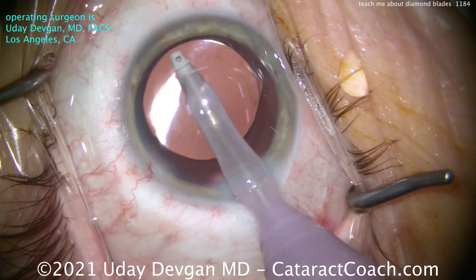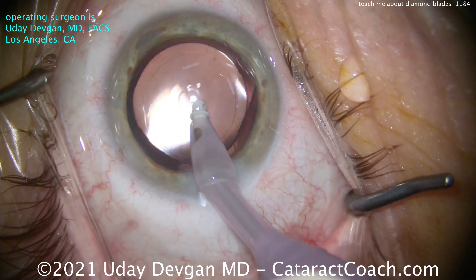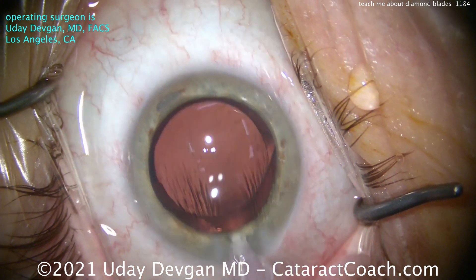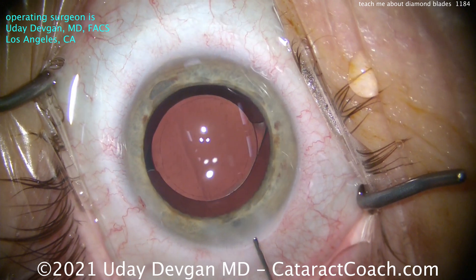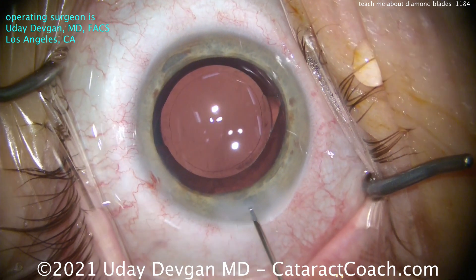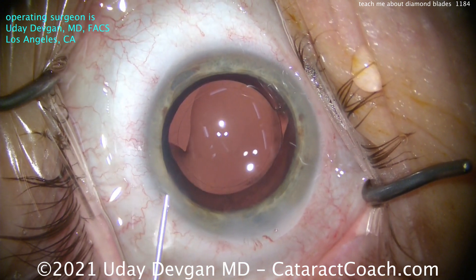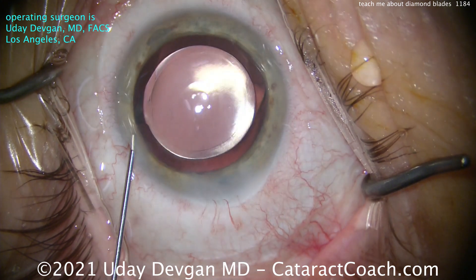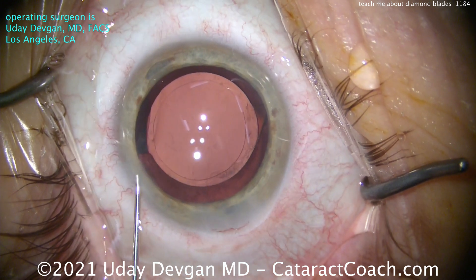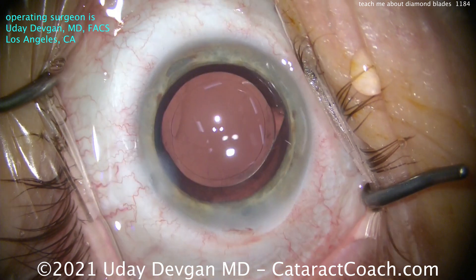So why have I spent $50,000, $60,000, $80,000 on diamond keratomes across multiple trays? Because I really do believe — and you believe too — that they make the absolute best incisions. I want to give my patients that same high level of care that I would want for my own eye. When I have cataract surgery in 20 or 30 years, I want that surgeon to use a diamond keratome to make a beautiful, clean incision that seals well and gives me incredible vision for the rest of my life — and I want to give that to all my patients.